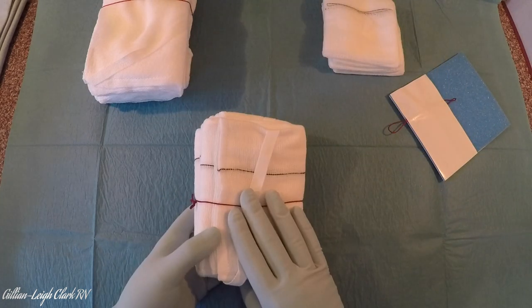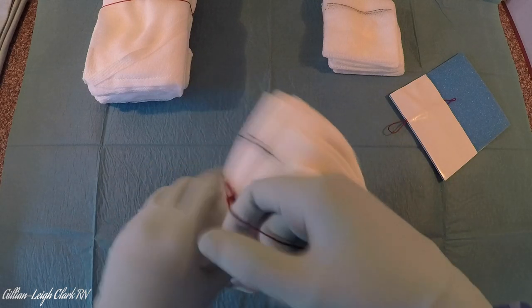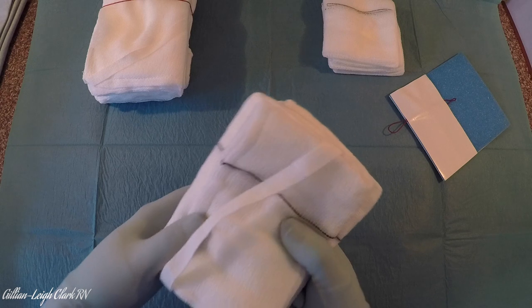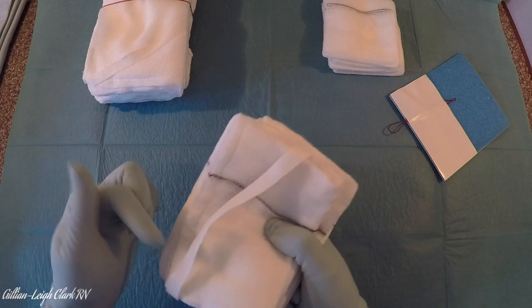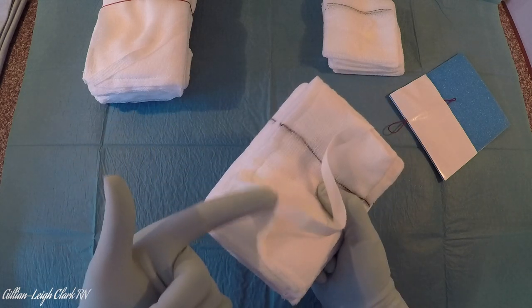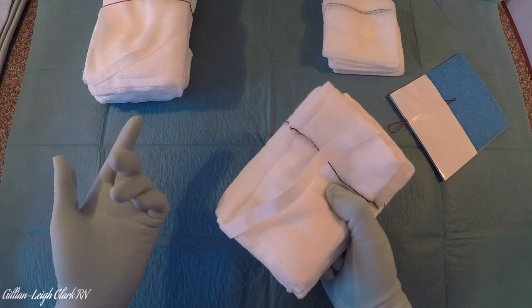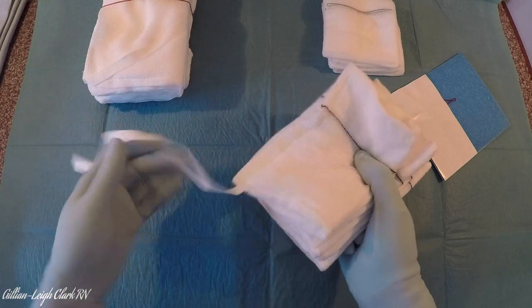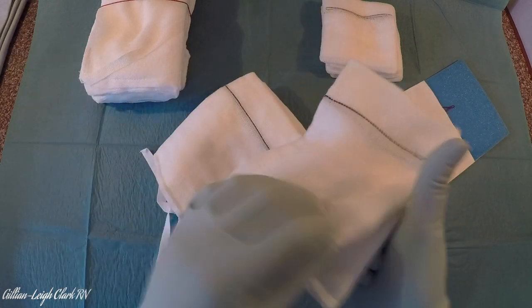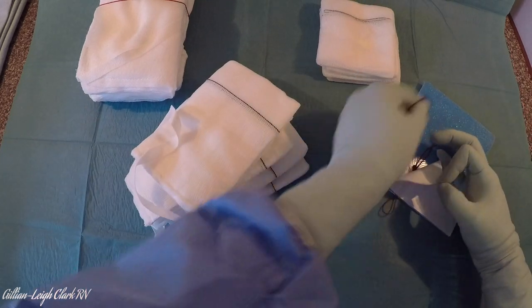Taped swabs are a little bit different. Again, check 5 with your floor person and you're both singing verbally and visually counting. The red tag comes off — one red tag. I tend to hold them in my right hand because of the way these ones are folded, but they come in many guises so you just have to find the best way that works for you. I'm going to pull the tape to check that it's attached — it's sewn in, but they can come off so we're checking that it's there. Then we're checking the swabs much like the small swabs: check 5 — 1, 2, 3, 4, 5. The red tag then goes in line with your policy.